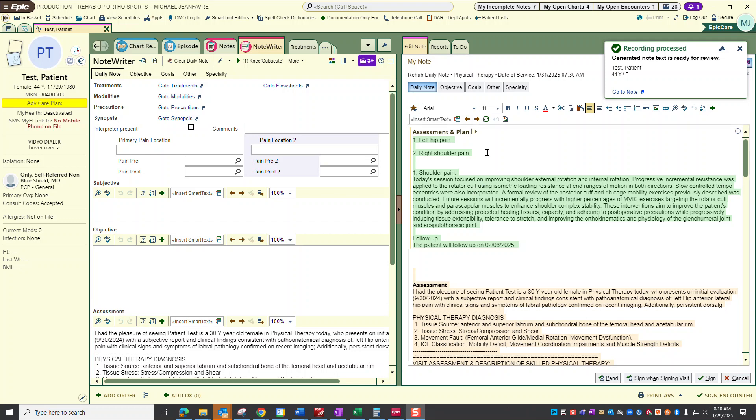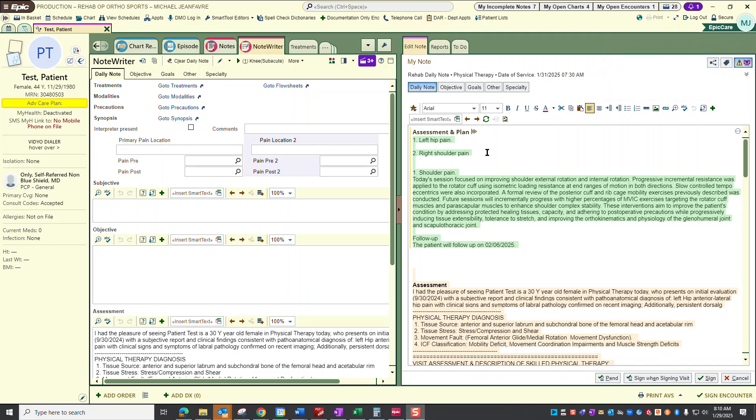This kind of proves out what I was describing. Even though I manipulated the text prior to actually dictating, it still populated.